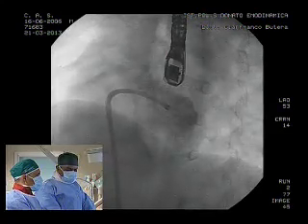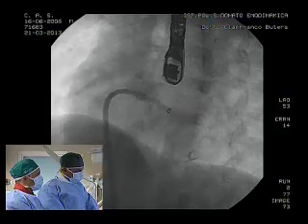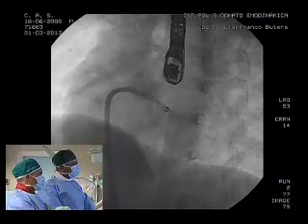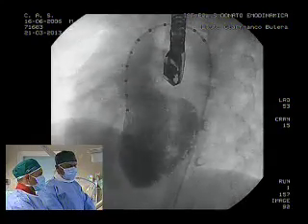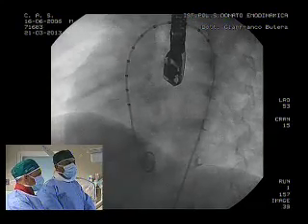First of all, I don't exactly agree with the description of the anatomy. The way I measure things, can you go back to the first angio, to the previous angio, please, Ziad? Yes, sure. Let's go back to the first angio. At least the one you're showing now with the sheath shows that the orifice on the right ventricle is between, I would say, 3 and 4 millimeters. Do we agree on the right ventricular side?